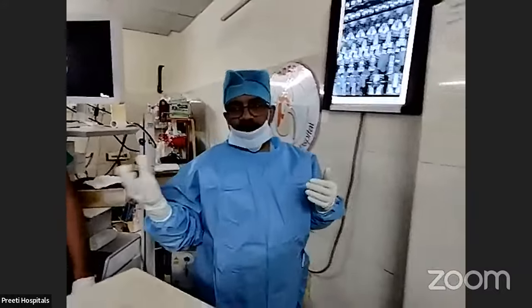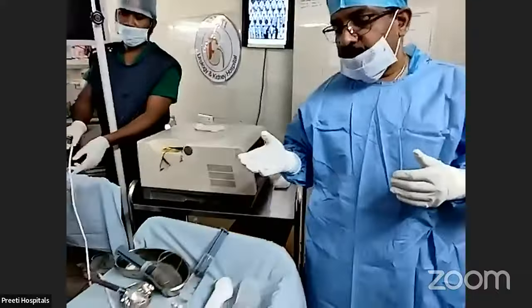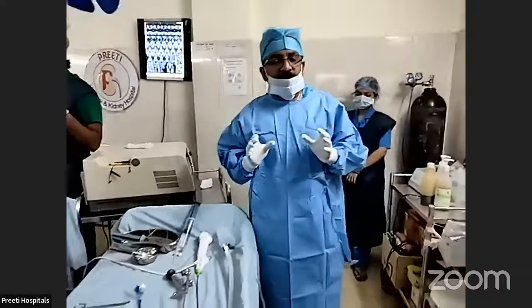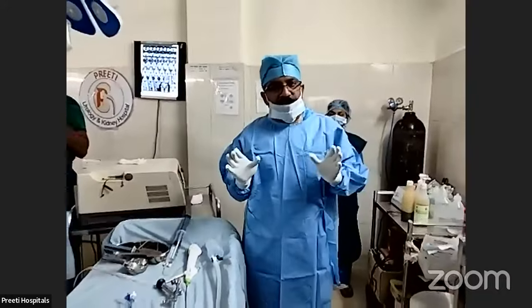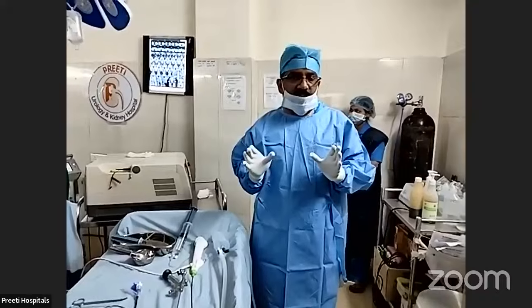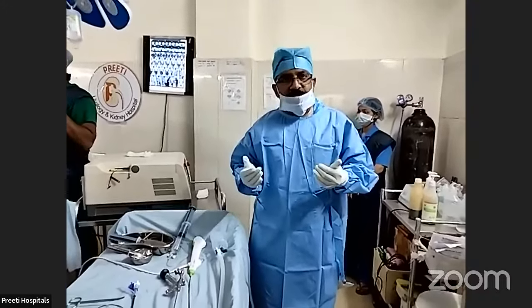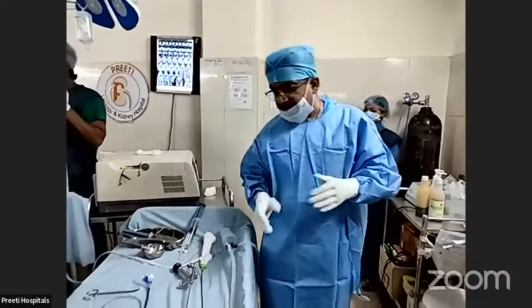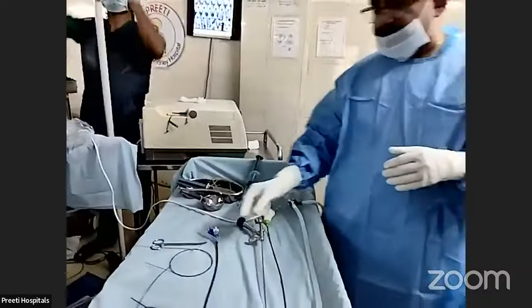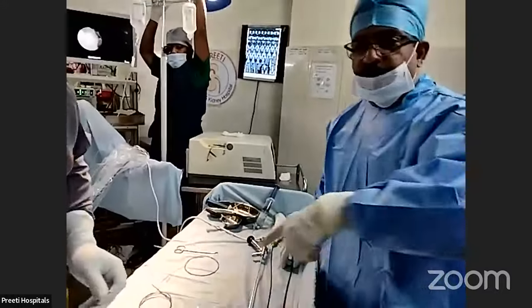So now coming to the armamentarium, instead of wasting the time, we are already well-versed, all of us, with RIRS. RIRS is retrograde intrarenal surgery for the stone inside the kidney. Now what we are doing is, we are passing normally a small access sheath. Where is that small access sheath? Show me. So we usually keep two tables like this.